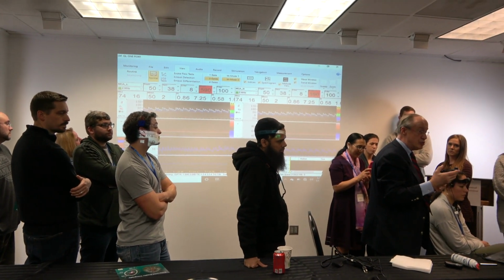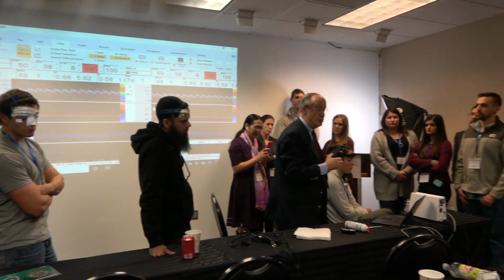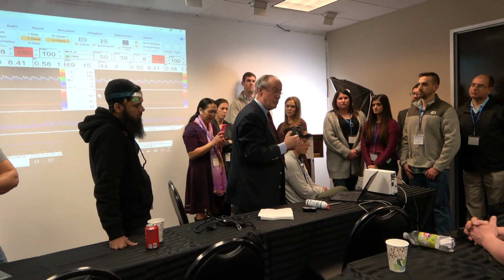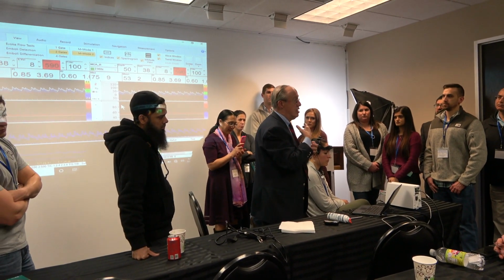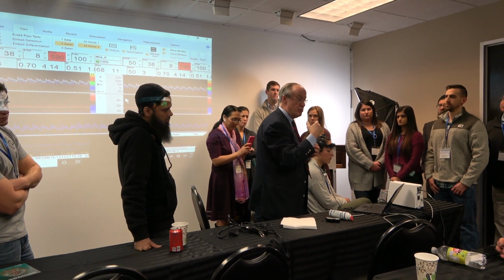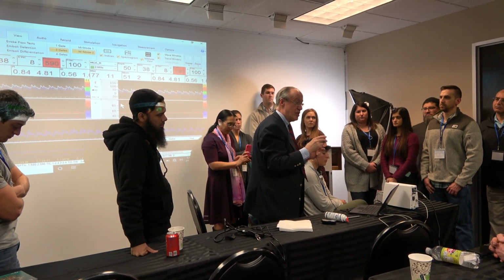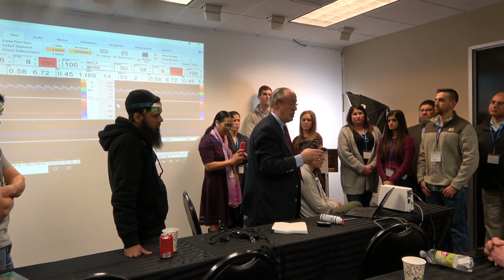For a patient with stroke, for example brainstem stroke, it's not easy to do a Valsalva maneuver because some of them can have difficulty breathing, and when you put in an esophageal probe, you cannot. And it is light sedation for patients, so they are not doing Valsalva well.